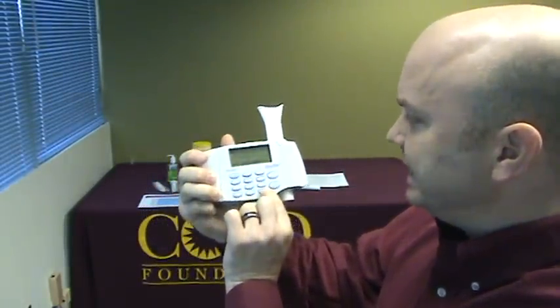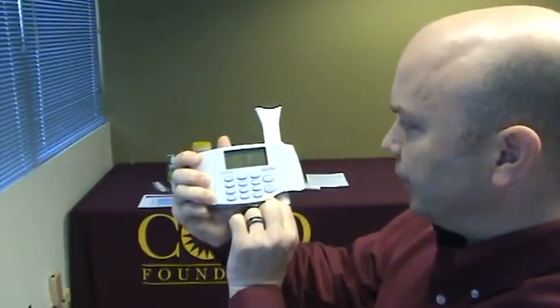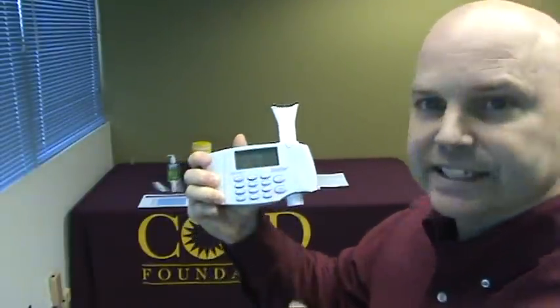Once we've reached this, we're going to go to the data screen and press enter. Then this series of data will be recorded on the report card sheet. We will discuss that in another lesson.